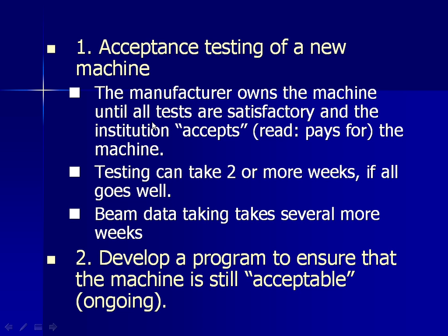By the way, there are dozens more task groups out there that have something to do with QA. Every time a new technique comes out, a task group will eventually develop that lays out guidelines for QA. I want to point out that the task group reports are available to the general public on the AAPM website, www.aapm.org. You filter through the website, and it used to be that they weren't accessible to the public, but now you can download them. And maybe I'll put a couple of them up on our website.